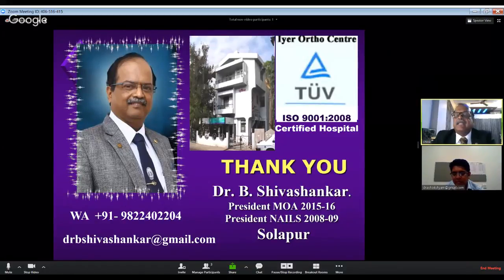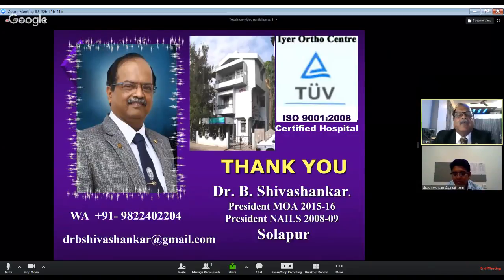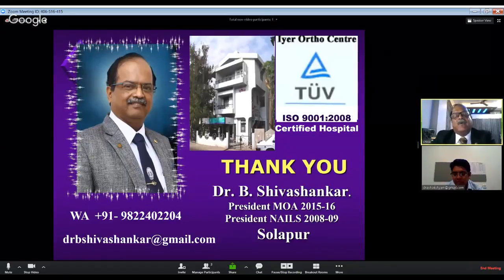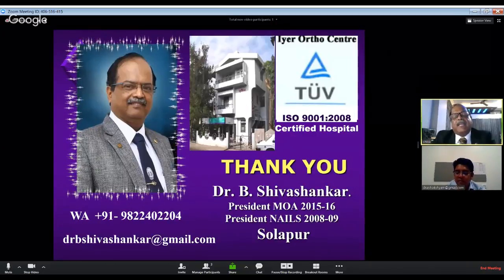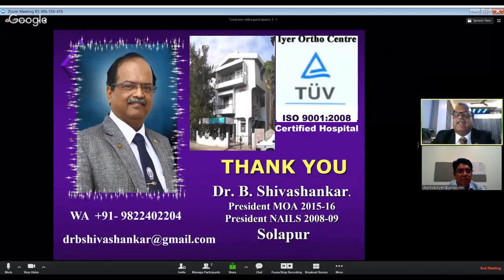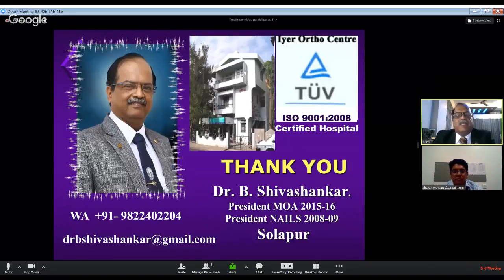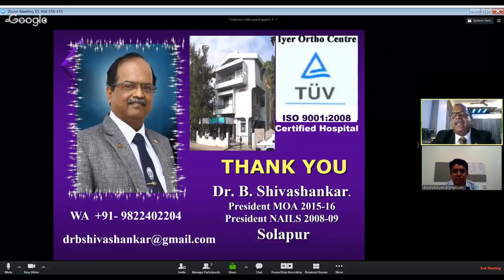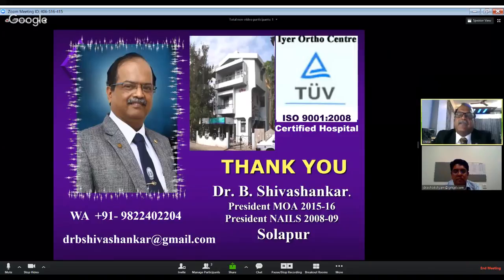Dr. Shishikant Ganjale from Solapur has come out with a buttress plate that is also very useful. You can put this plate over the lateral cortex, the comminuted lateral cortex, and against this plate, the head of the screw will be sitting. But I find no difference by pushing the screw much more inside, deeper, and trying to fit against the nail itself. I have shown enough number of cases and I have done enough number of cases.